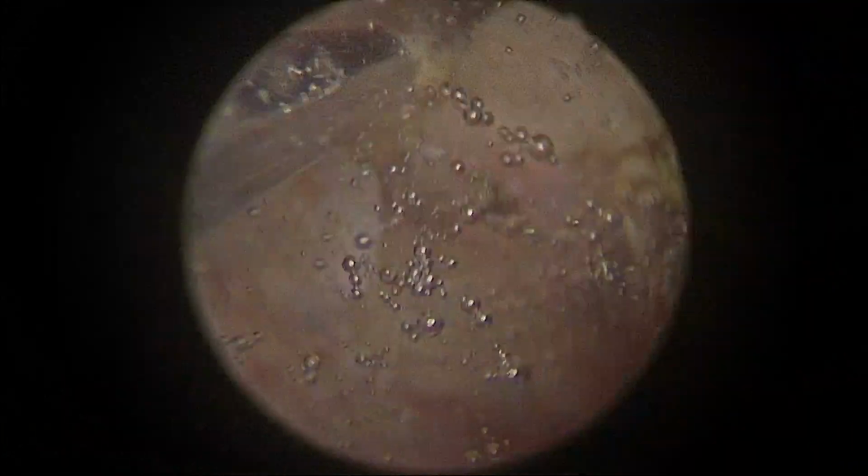Then the myoma will come into the uterine cavity, and now it becomes type 1. If it is massaged and nibbled out properly, it becomes very easy under vision to take out the myoma. So this is one way of making a type 2 myoma into type 1 myoma and then doing the hysteroscopic myomectomy.